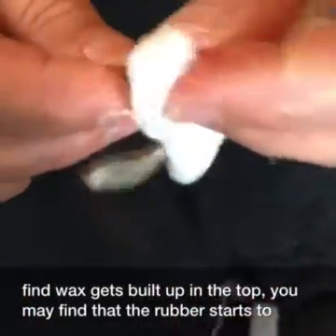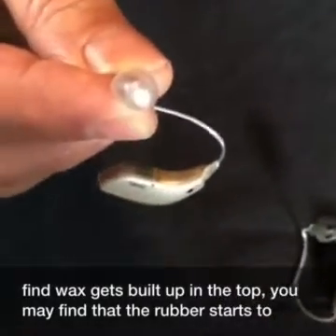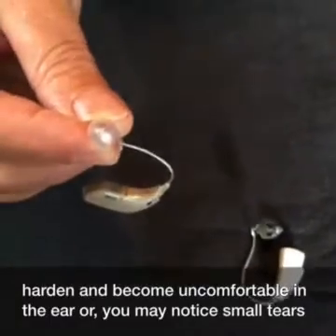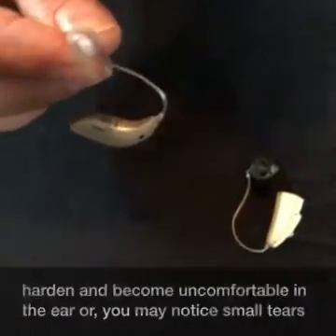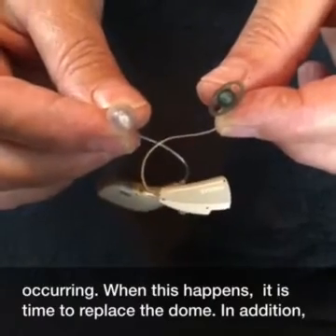But periodically, you may find wax gets built up in the top. You may find that the rubber starts to harden and become uncomfortable in the ear, or you may notice small tears occurring. When this happens, it is time to replace the dome.